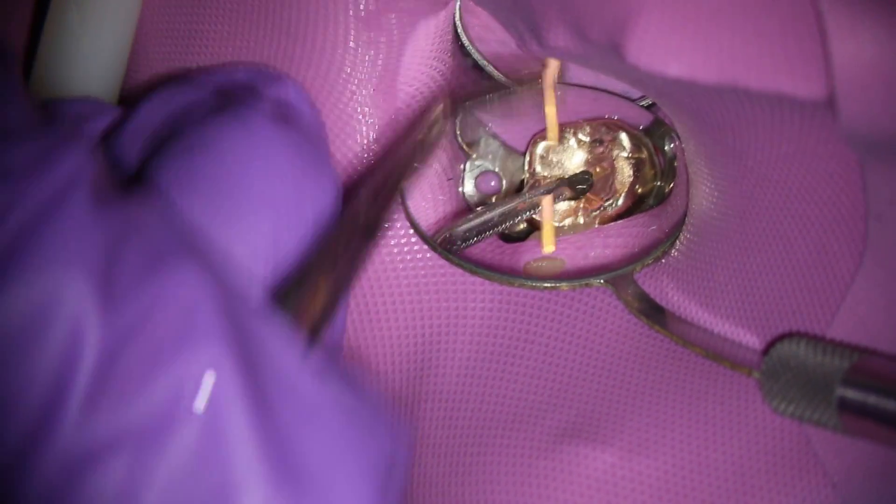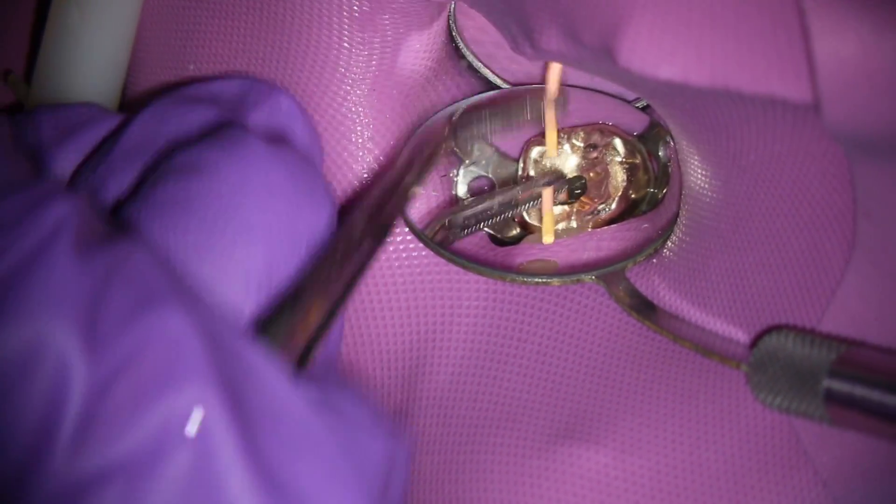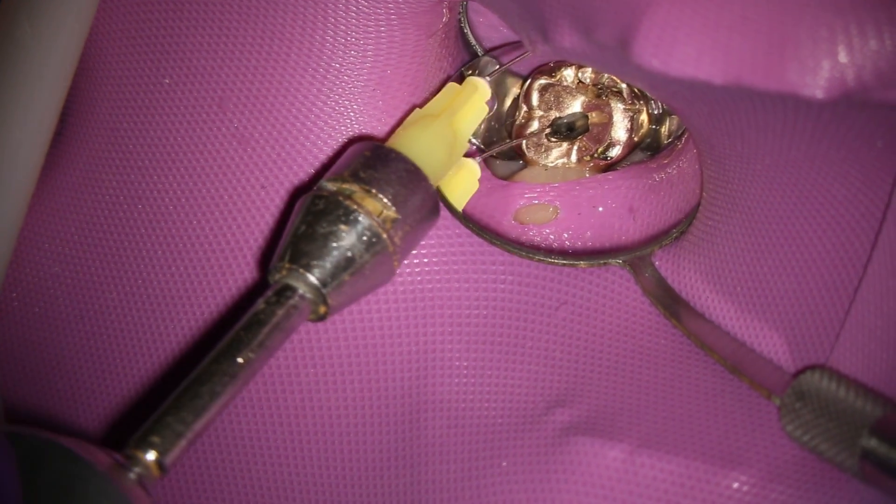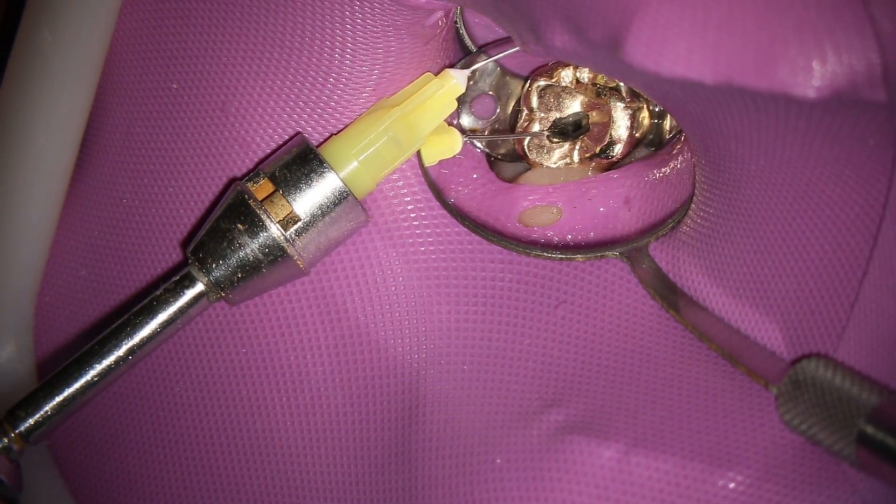And then I'll just pump with alcohol in place with a couple of gutta percha cones, and usually try to go through the terminus with the gutta percha cone, just trying to remove a little more of the remnants of calcium hydroxide. Then I go in with the normal air and water and dry it out, and then I go to the air-only stropco. We completely desiccate the canal with the air-only stropco.